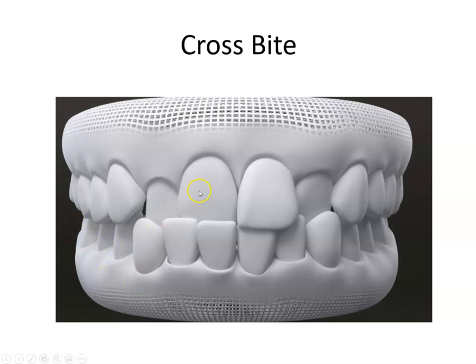However, at times you have the opposite where the lower teeth are moved out and the top teeth are pushed in, and you have what's called a cross bite, or they cross over their position. This specifically, if everything else is good, the cross bite is an issue. We mainly would refer that this is a generally crowding space with a cross bite in the front because the back looks normal.